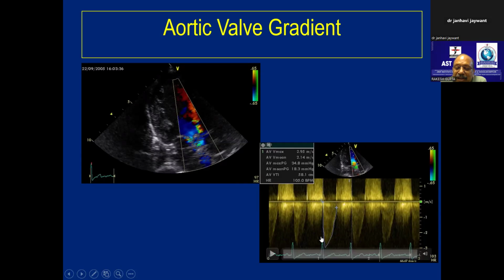Okay, now you got the answer. I'll give you a better answer. Look at this Doppler spectrum pattern over here. Can you see it? Look at this small spectrum pattern seen over here, this one. Can you see this turbulence? There are two Doppler spectrum patterns, one inside the other. One is over here, one is over here.